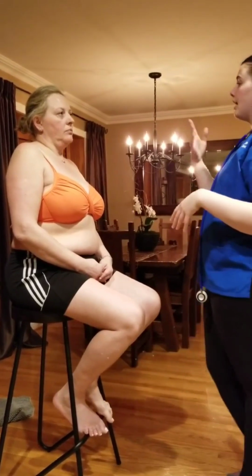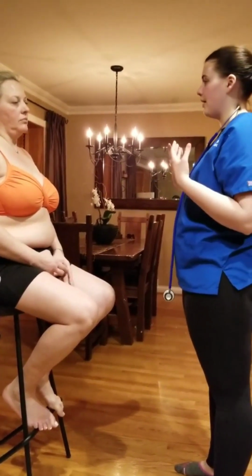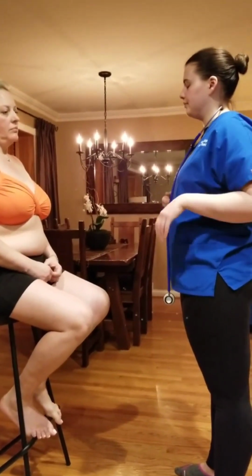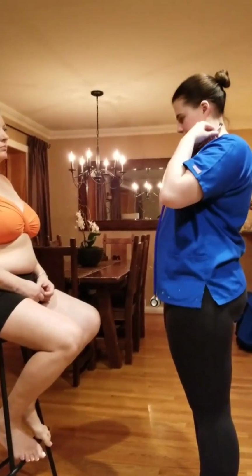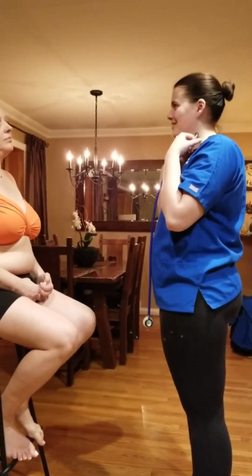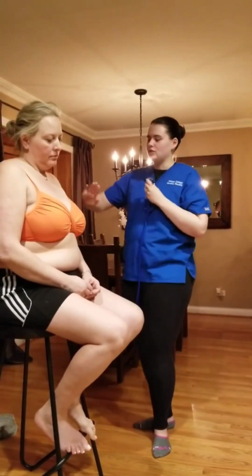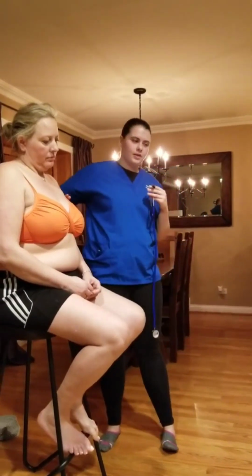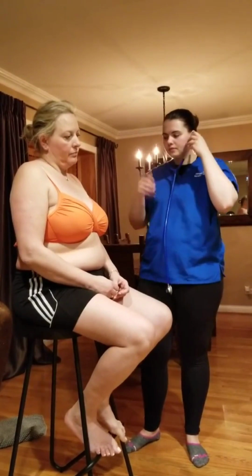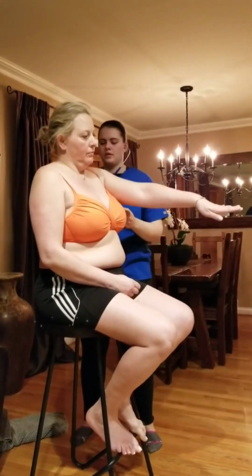And looking at and noticing your respiratory rate, it was within a normal range. You don't look like you're using any accessory muscles, no bulging, without difficulty. You don't have difficulty breathing, right? No. Okay. And then I'm going to listen to 2 sites on the left side and then 3 on the right. Okay, lift your arm for me. Breathe in.